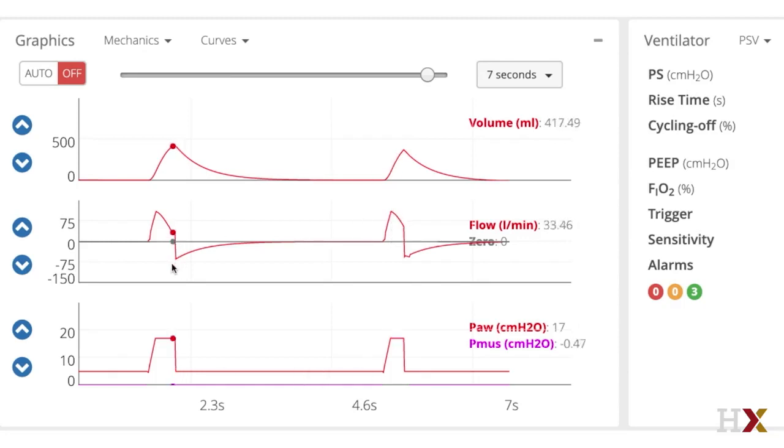in fact, if you see here the expiratory flow, there's a peak and it's exponential, whereas here there's a little bit of a dampening in the peak, and that's because the effort is actually still continuing even though the ventilator cycled off. This is a form of desynchrony or asynchrony called premature cycling or short cycling. So the ventilator cycled off before the patient was done the effort.